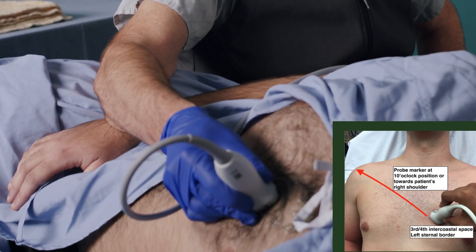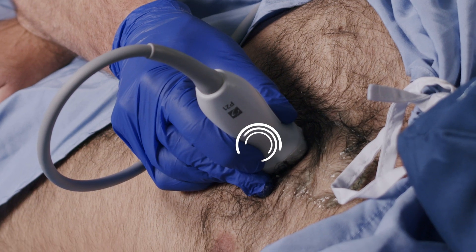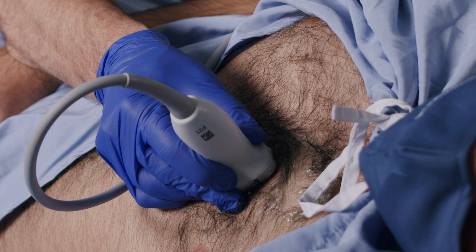We will orient the probe marker to the patient's right shoulder. A good place to start is the fourth intercostal space, just lateral to the sternum and at the level of the nipple line. If we go too far laterally we'll run into lung. If we're too far medial we'll hit bone. The trick is to find a sweet spot, which is usually fairly close to the sternum.